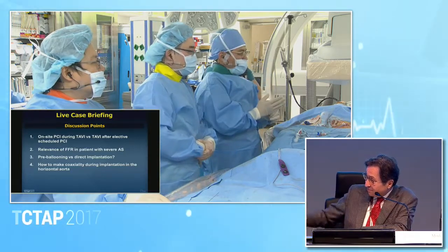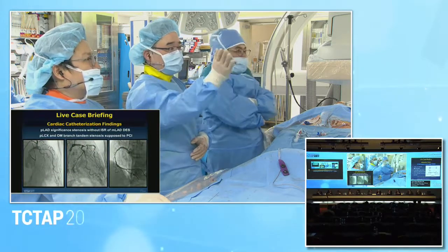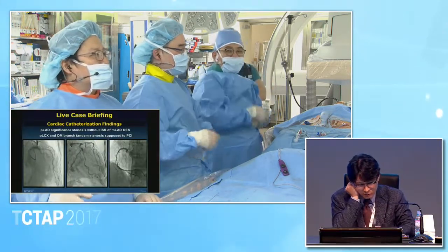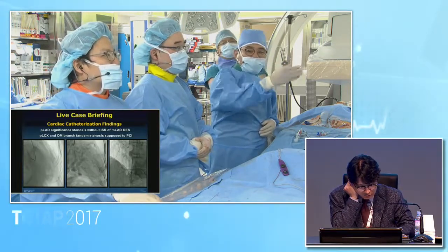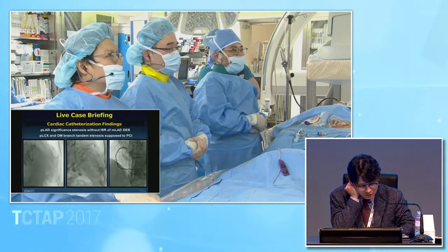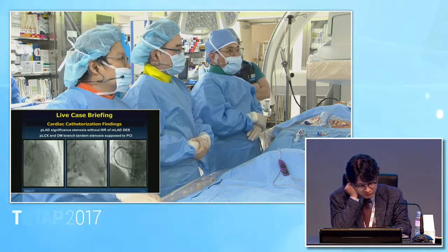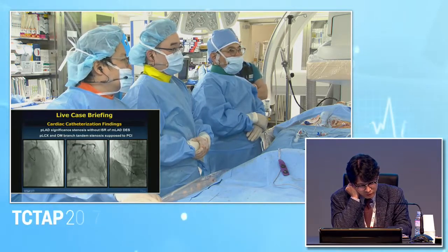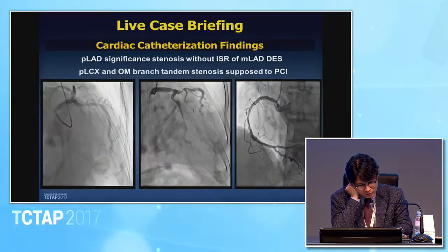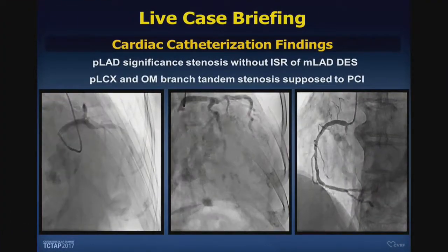What do you think? I don't agree. Even in this, would you please do the baseline angiography, Dr. Chung? Would you please give us some angio? Yeah, baseline angio. Can you see? A lot of complicating situations. So if I were you, just the little touch, very little touches of circumflex only. So what about those FFR values at that time?